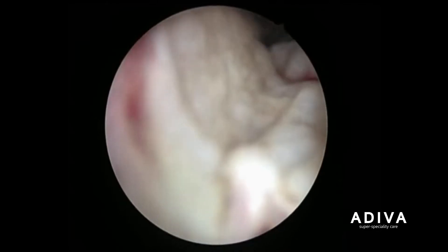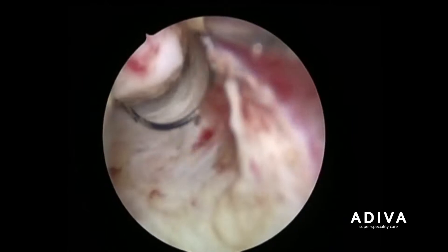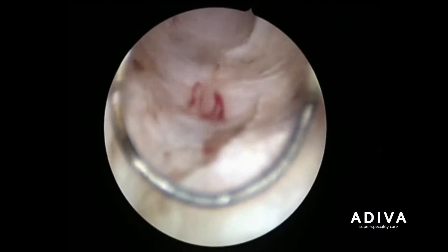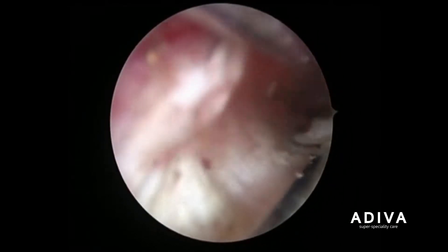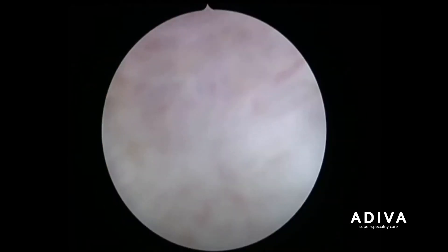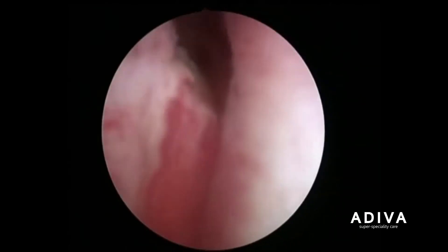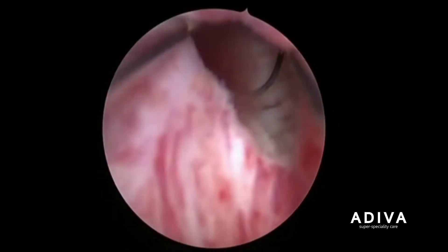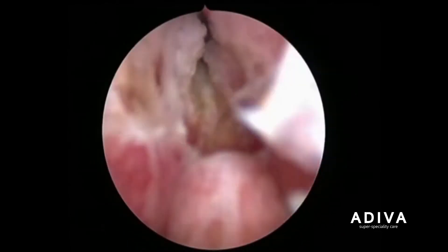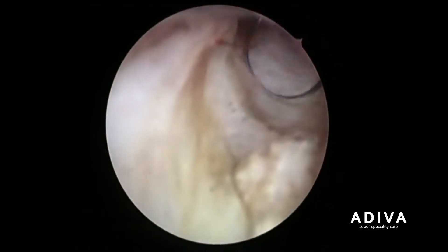Here you can see the loop through which electrical current is passed and it removes the gland in piecemeal. This is a little different than the Holmium procedure where it is removed by enucleation and the adenoma goes as a complete piece, but here we are removing the gland in a cutting manner, piece by piece.